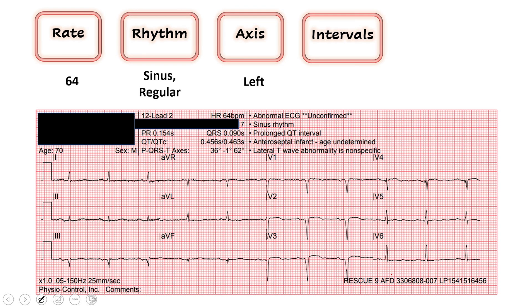Then our intervals. The two we look at are our QRS — we want that to be less than 120; this one is 90, that's good. And then our QTc is 463. Greater than 450 is technically long, and greater than 500 is at risk for spontaneous arrhythmia. So this one is longer than it should be. We'll keep note of that and consider our medications that we might give this gentleman if we need to.